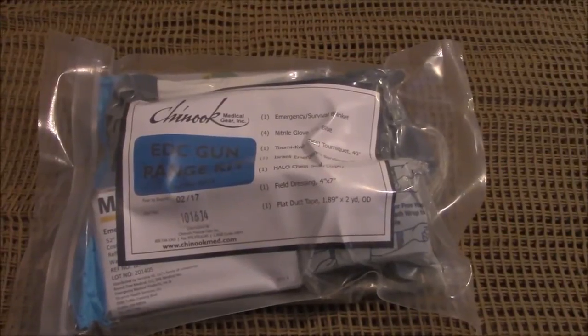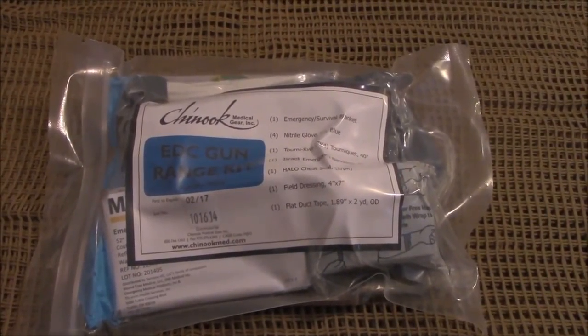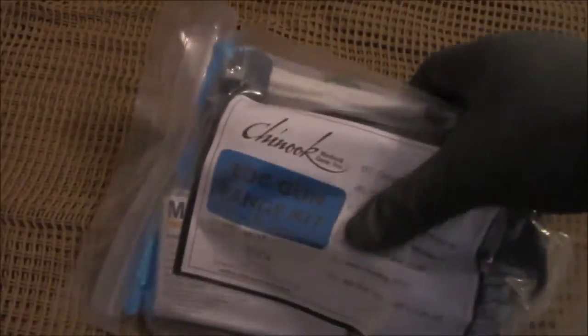Each kit comes in a sealed bag so you can tear it open. You can see at the very top right there that it's got a little slot on either end to rip it out, and it's a self-ziplocking bag so you can reseal it.